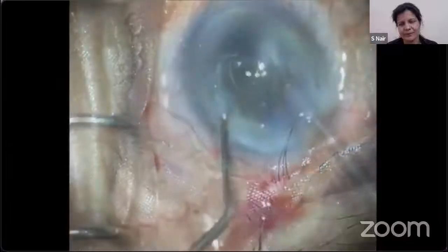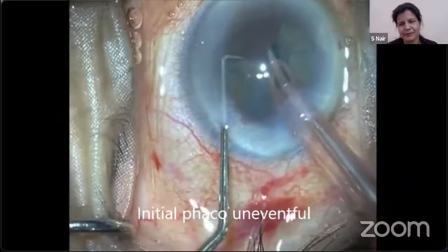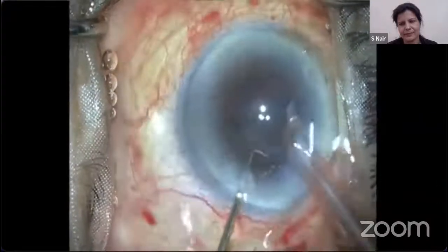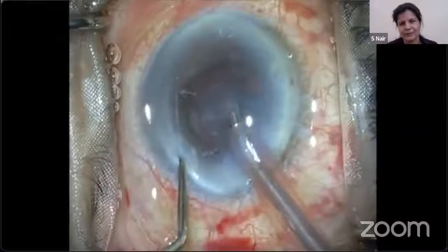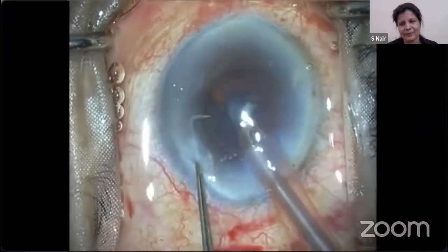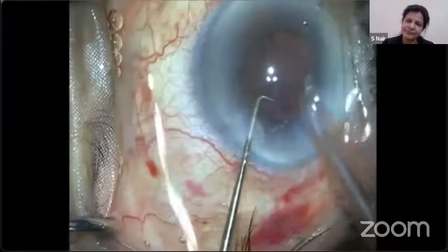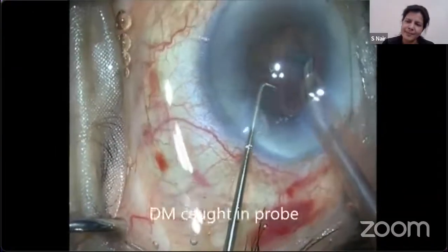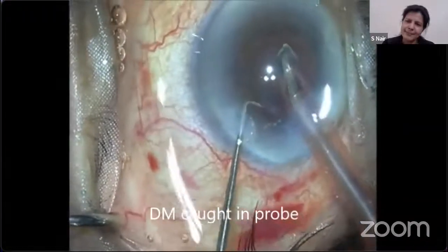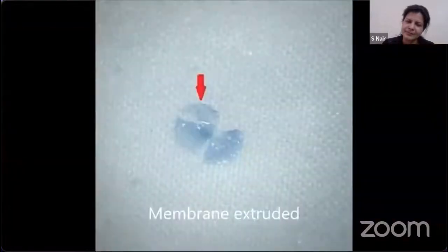The initial part of phacoemulsification is uneventful for the eye, though it's causing a progressive DM strip. During the later part, a portion of Descemet's is caught in the phaco tip. Here it is fully stripped and extruded from the eye.